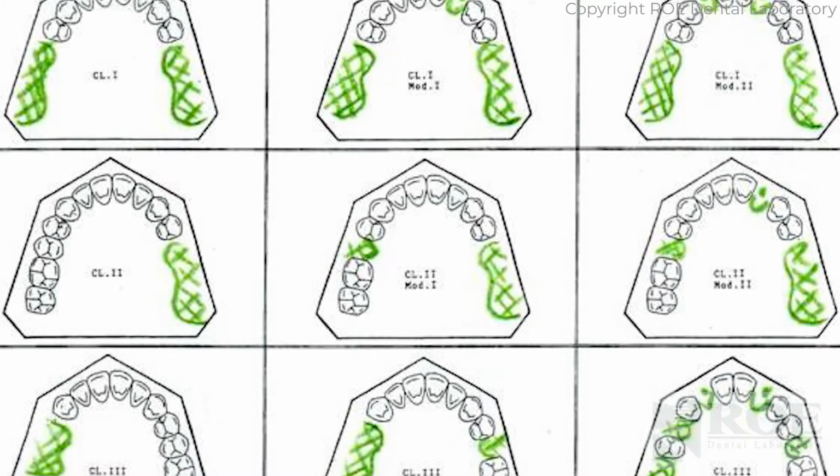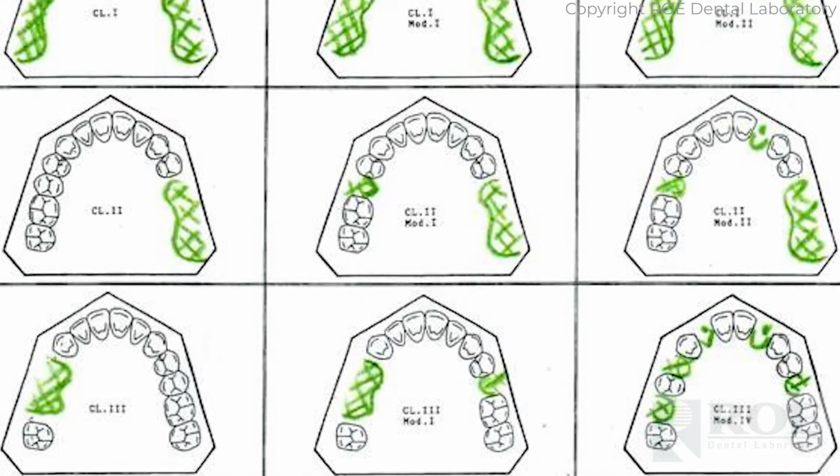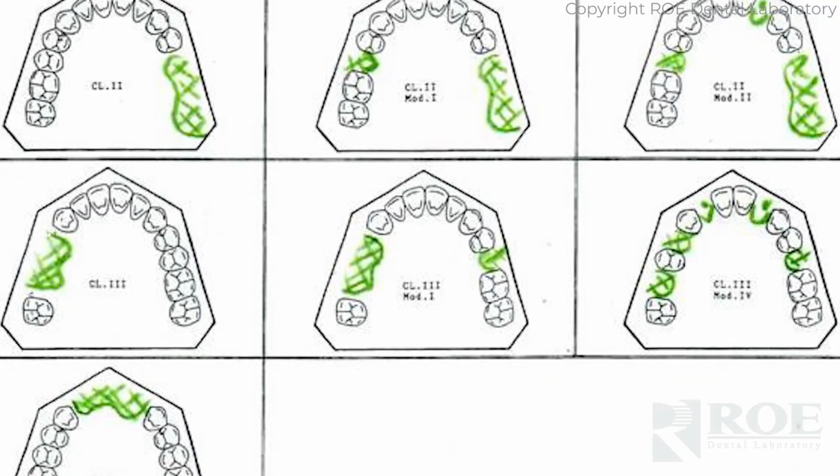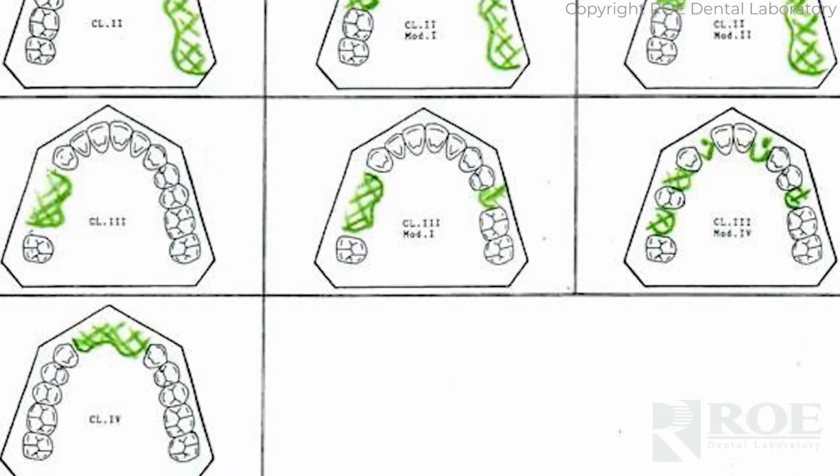So back to the fundamentals, the Kennedy classes of partials. Which of those are the biggest challenge for the clinician to restore? The Kennedy Class 1, which is a free end distal extension partial, it's not a challenge to restore, but it's probably the most difficult one to design for longevity. If the correct clasp isn't designed on there, and minor connectors aren't placed in the correct position, they can cause tooth loss. Any partial with a free end distal extension, the abutment tooth is always at peril. So a badly designed partial is really a tooth extraction device.